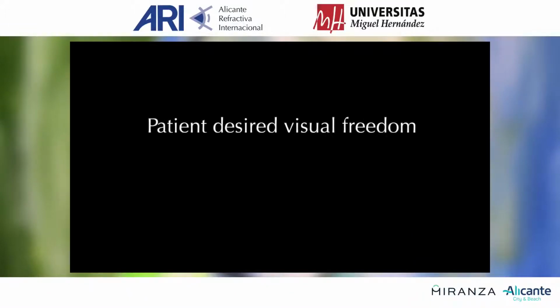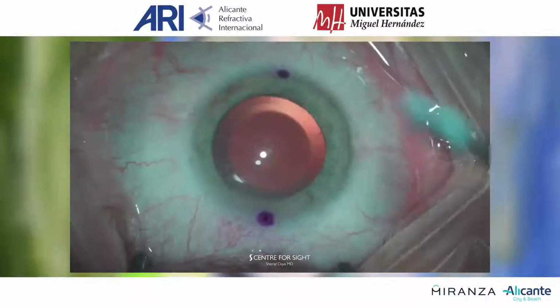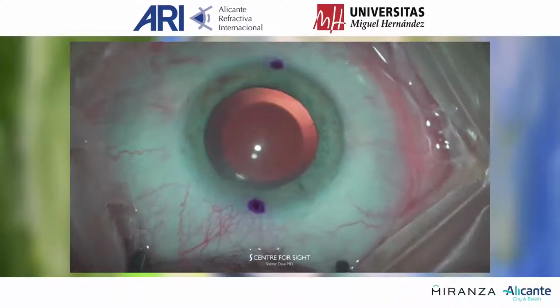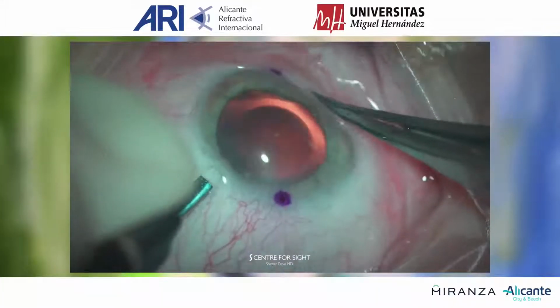The question was, could we provide her with her desire of visual freedom by giving her a full range of focus lens and also correcting her astigmatism? This is the surgical case. You can see that the cornea has been marked for a toric lens. Two paracenteses are performed.